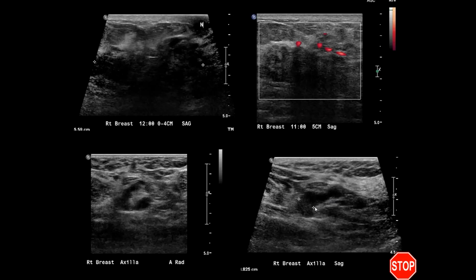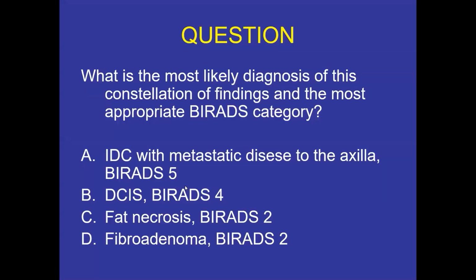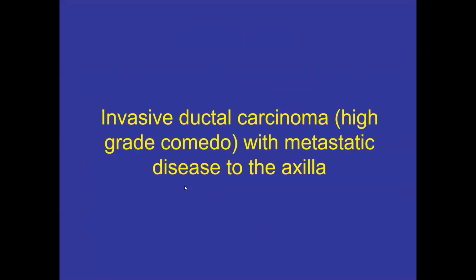And then when we look at the axilla, we see this lymph node that has a hypoechoic cortex, but we see that the cortex is thickened. So the normal cortical thickness is 3 millimeters, and it's up to 8 here, and it's focally thickened. You can see here it's probably about normal, and so focal thickening, and here you can see characteristic rat bites, kind of, where the cortex is going into the hilum. The hilum's the echogenic area, the hypoechoic area is the cortex. You can kind of see this focal little, it looks like someone's taking a bite out of the hilum, and this is very concerning for metastatic disease. Versus if it was uniformly thickened, you think more of something systemic reactive, something like that. So very good. And of course this we know is a cancer, right? We don't even have to question that.